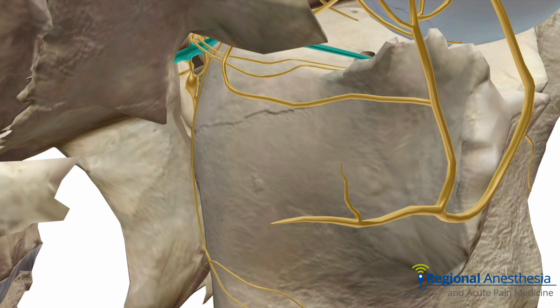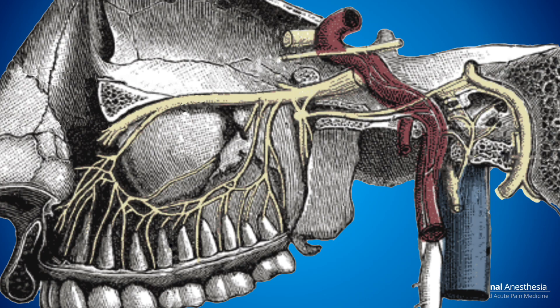Visible in this fossa are a number of nerves. The big chunky one running through the superior aspect is the maxillary nerve — the second branch of the trigeminal. There are two fine connections dropping down from this; these are the ganglionic nerves, and they allow crosstalk between the somatic maxillary nerve and the parasympathetic sphenopalatine ganglion, seen here dangling down from the maxillary nerve. We're going to drive our needle straight in, aiming for the lateral pterygoid plate — but more on that later.